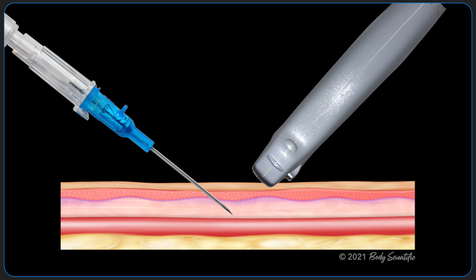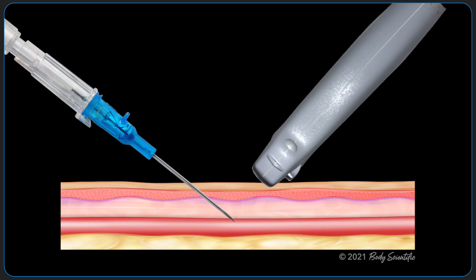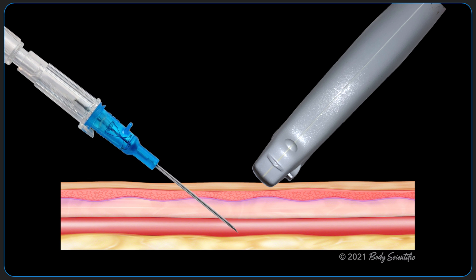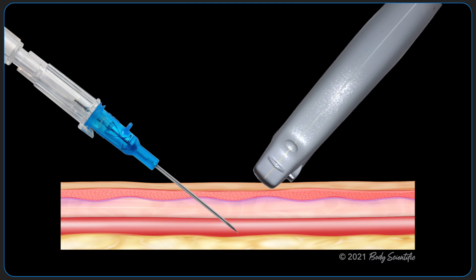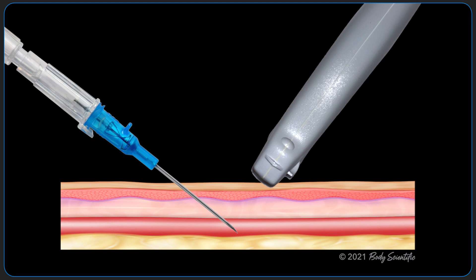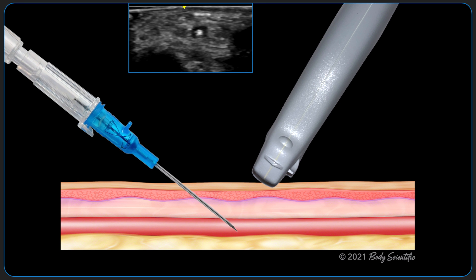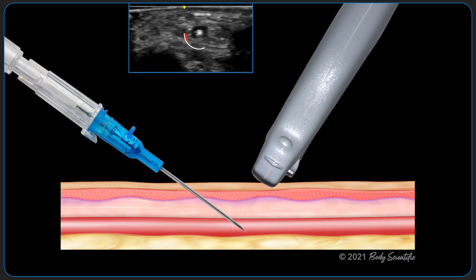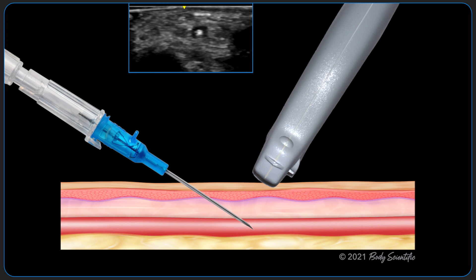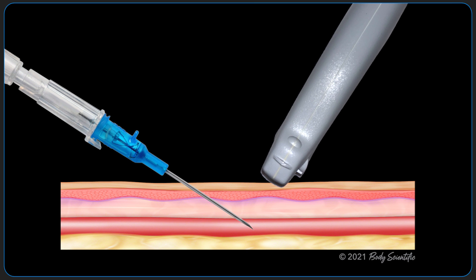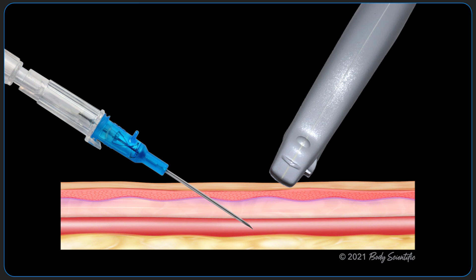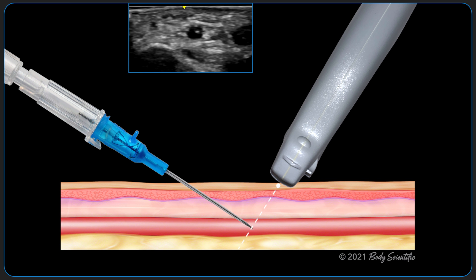The second stage of tracking the bevel is after entry into the vessel itself. Tilting of the probe is less important here due to the echogenicity of the bevel head against the background. The angle may be either maintained or decreased. The body of the bevel is bright and hyperechoic in the lumen. As the transducer is translated proximally, the bevel seen in the lumen becomes smaller and smaller until it disappears.